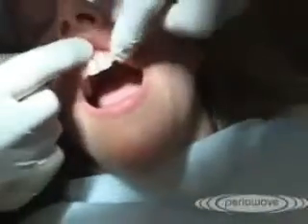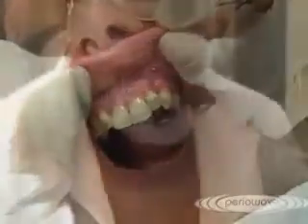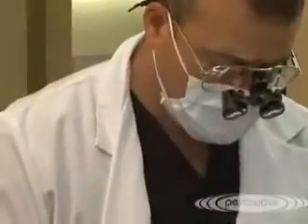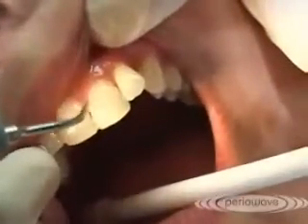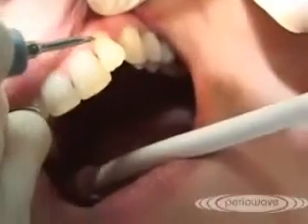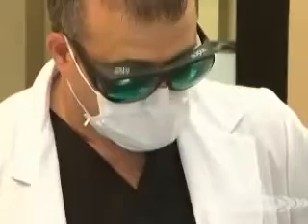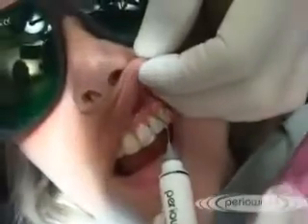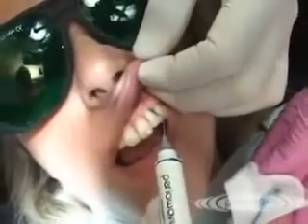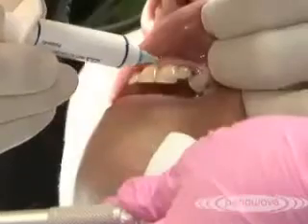And again, if you take a look at the stippling of the tissue — lack of bleeding compared to three weeks ago. The goal after three weeks of initial therapy is to lightly debride the areas that you want to retreat and follow up with the PerioWave treatment in those localized areas. Specifically, we're going to treat tooth 22 distal, which was our largest defect. It's nice to note that the cannula doesn't go nearly as far as it did. I stress the lack of bleeding.